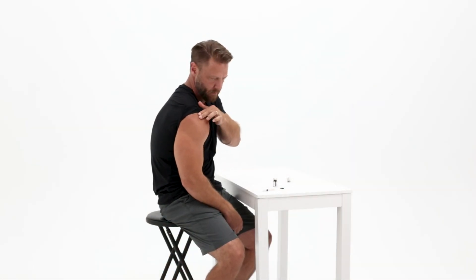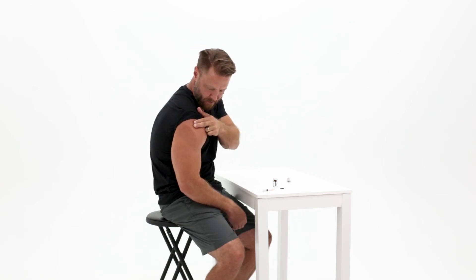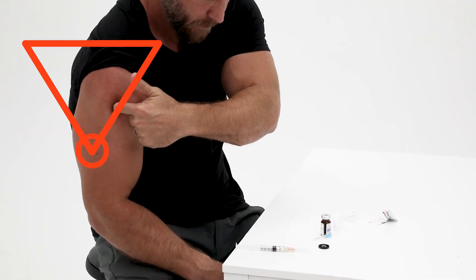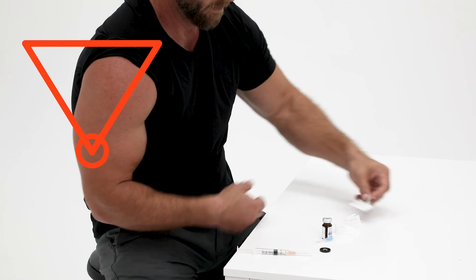If you are injecting intramuscularly in the upper arm, start by feeling for the top of your shoulder where the bone is. Imagine an upside down triangle from that spot and inject at the point of the triangle.